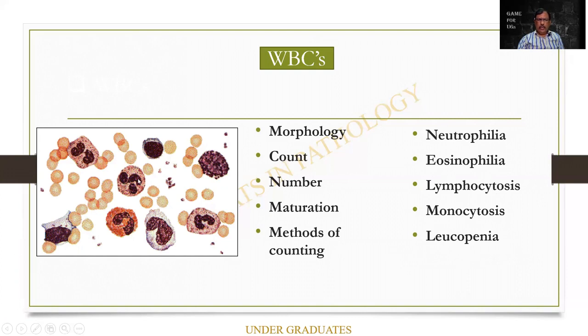Neutrophil, there can be 2, 3, 4, or even 5 lobes. And I find a granule with a neutral color. So that is why it is called a neutrophil. Brick red granule, eosinophilic granules. And there can be a bilobed or sometimes even a trilobed nucleus. Therefore, I want you to diagnose it by means of the brick red granules.